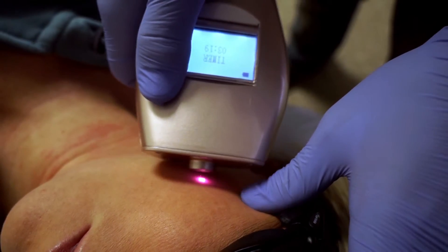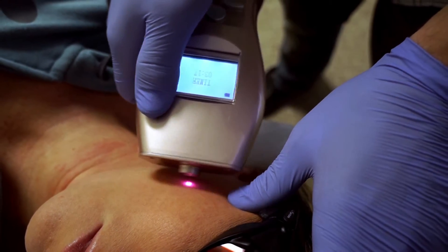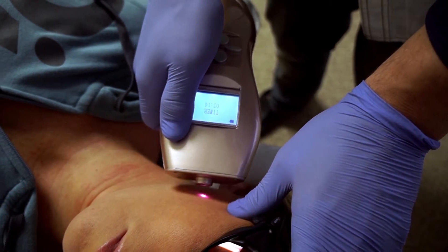With your other hand, using your finger, push up the skin and go in circular motions with the laser.